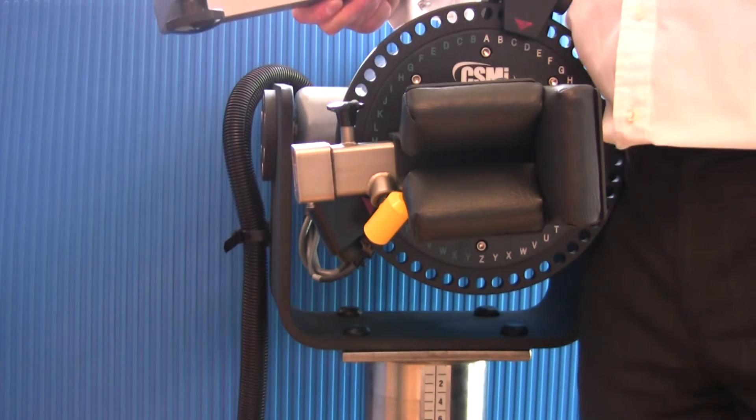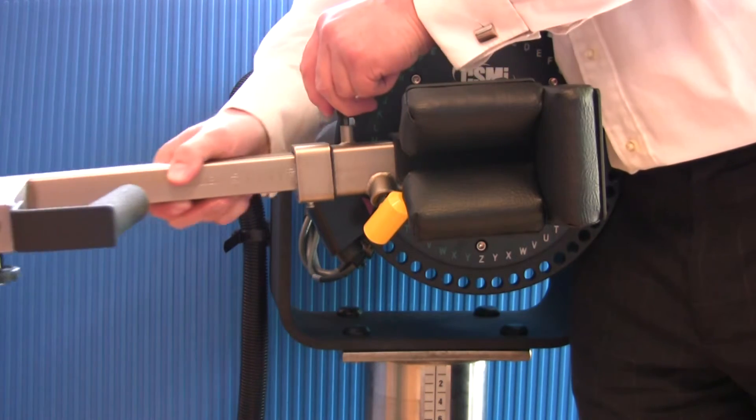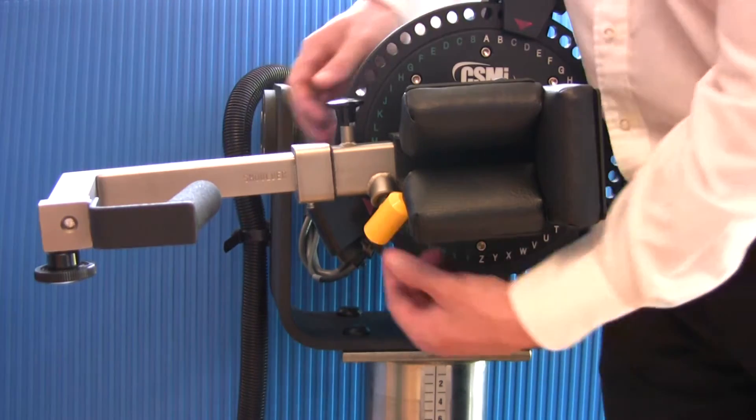Then install the wrist shoulder adapter into the long end of the input arm. Ensure the handle faces away from the dynamometer face. Pull the locking pin to allow full installation. Secure with the locking screw.